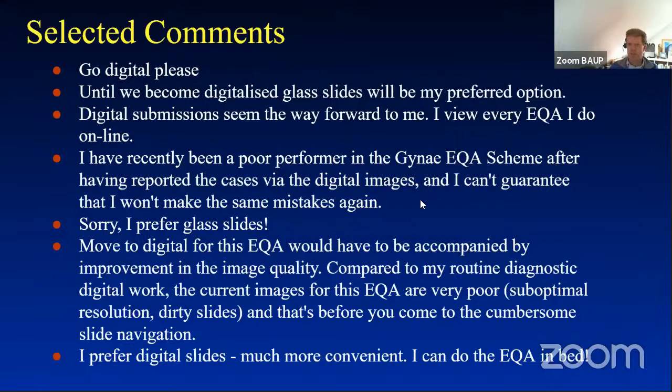Other people are saying that they've had problems with other schemes, because this questionnaire was really aimed at that. During COVID, a lot of schemes went digital, and we had problems scanning the slides. So they were scanned with our scanner, and that's why they were all dirty, because I obviously didn't clean them quite as well as the Leeds people, because the Leeds scanner was offline due to COVID shutting down the university.